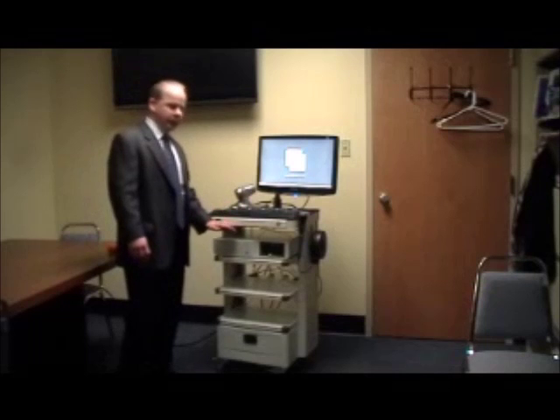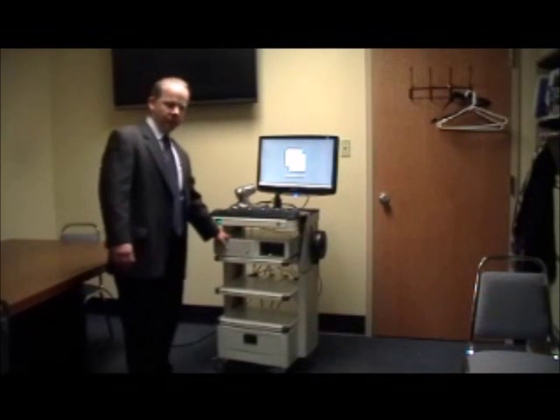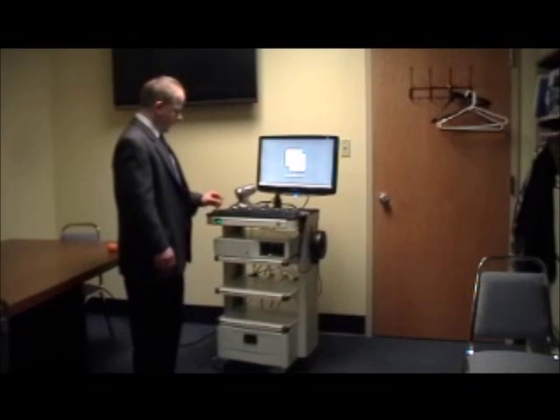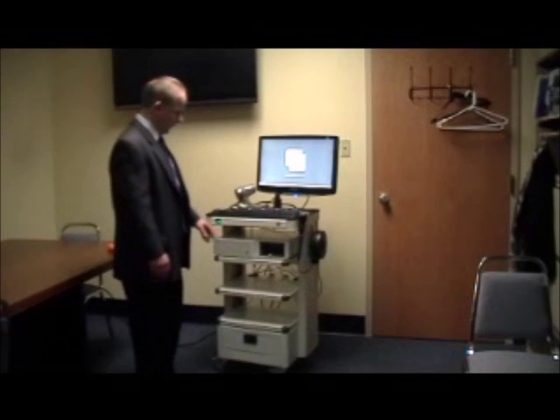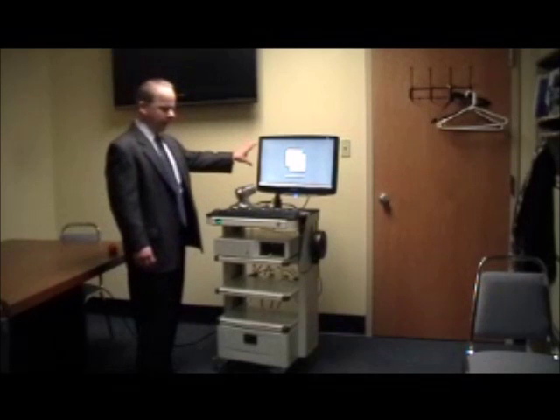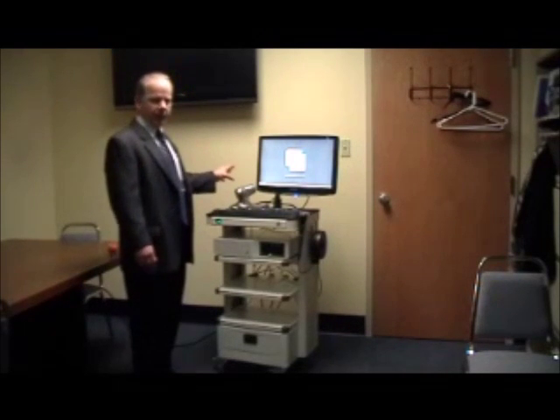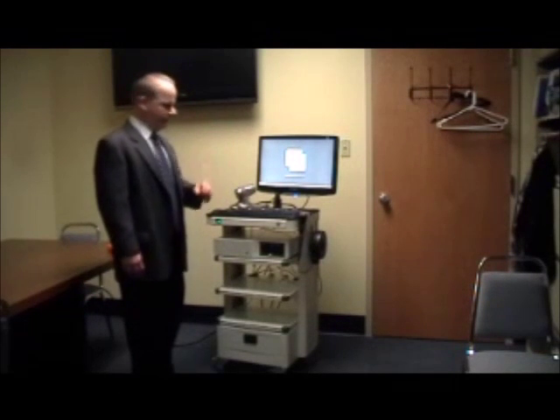We've got an image capture and video recording device that also supports video streaming and two-way conferencing. It's got a hard drive in it that can store the pictures and videos that are taken. We've obviously got keyboard and mouse, display, and we also have a room camera that can be used for pan, tilt, and zoom for wide out views or fairly close in views.